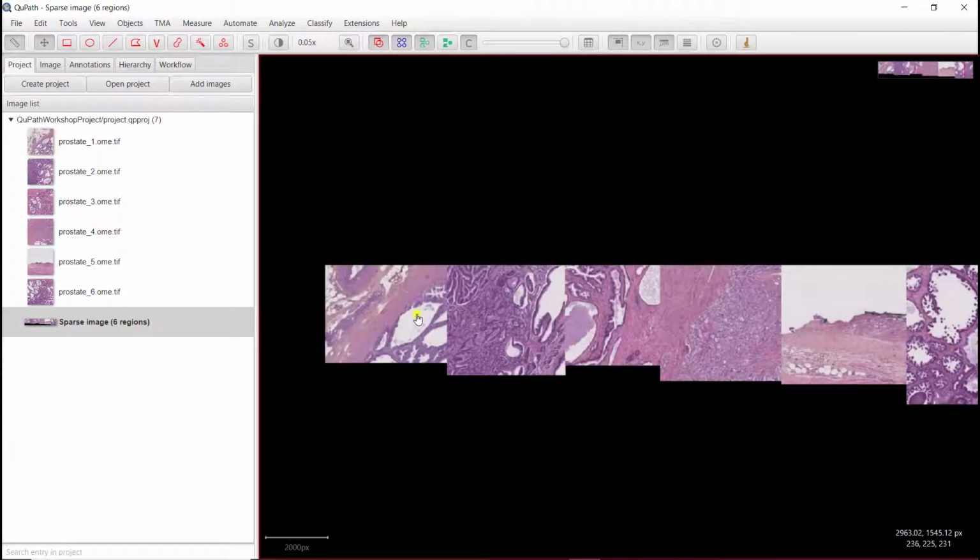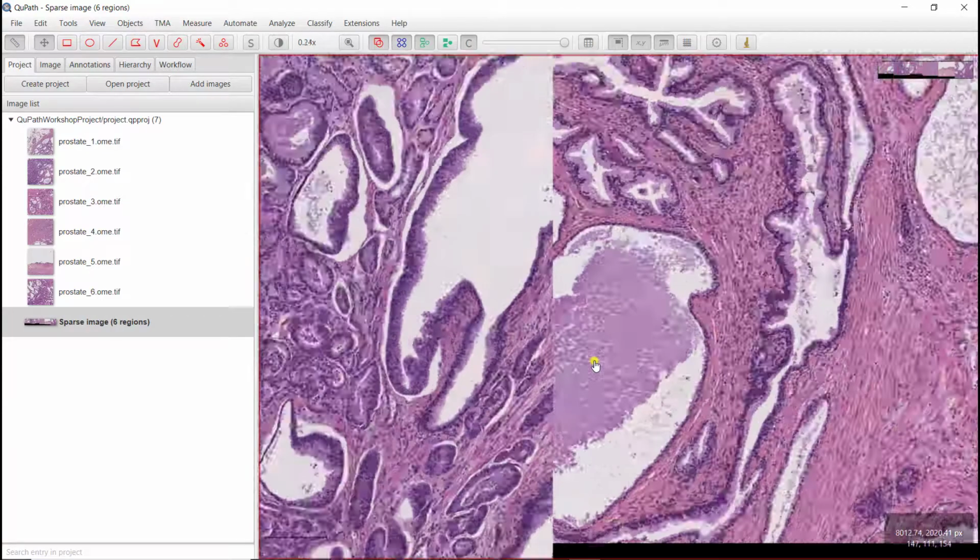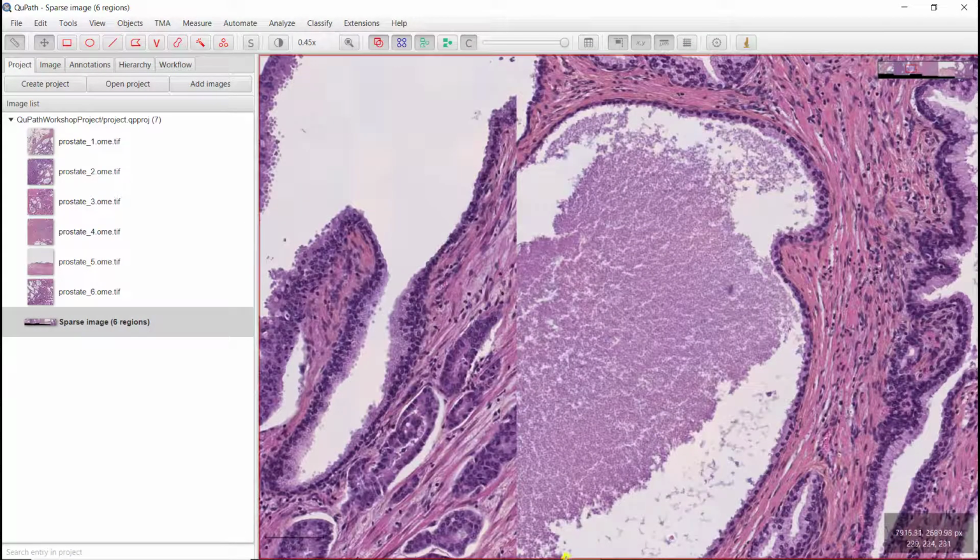It can also be interesting to think from the beginning about other regions that might be of interest. So here we're going to stick to that, but clearly, when you have this, for example, this is not epithelium. This is not stroma. So we'll define it as background.